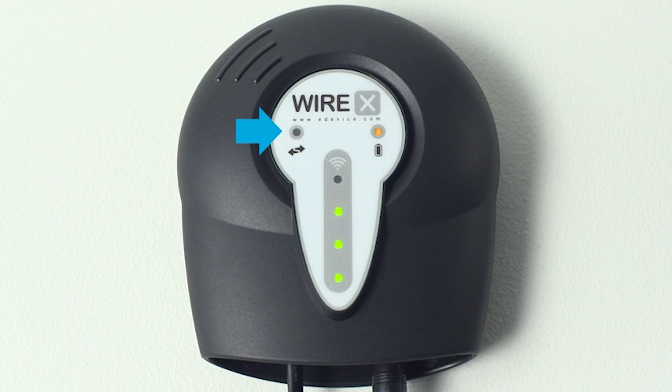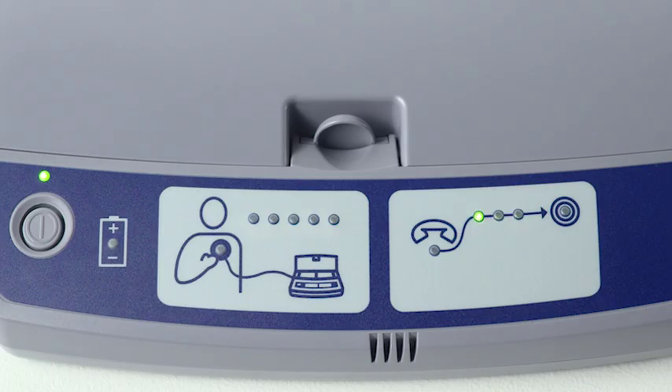During a transmission, you'll see the information light on your cellular accessory go on. A solid light confirms that your heart device information is being sent. Your CareLink monitor will indicate that your heart device information has been collected and transmitted in the same way it always has, signaling a completed transmission with a lit-up bullseye.